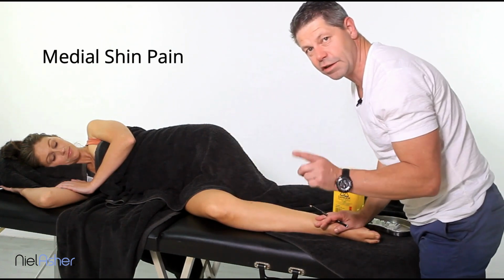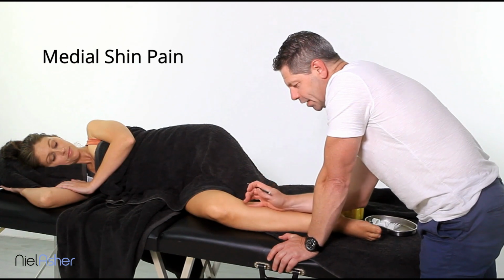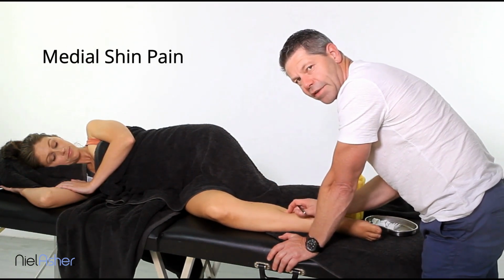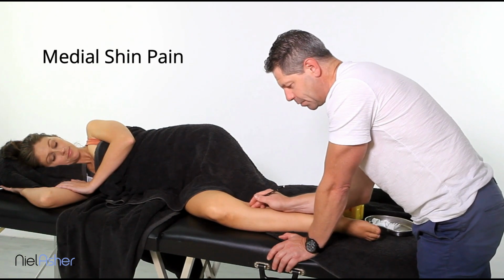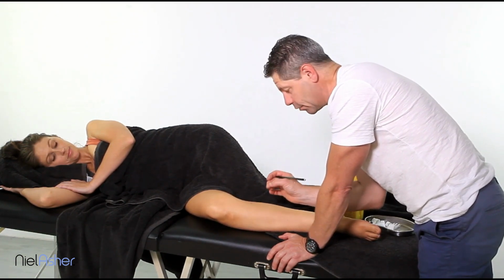So these are the ones that we're going to focus on. Now, in order to needle these areas, the deep compartment, this is so important: it is the edge of the tibia that we want to find. That's our bony landmark, and it is so important, because we're going to needle up against that and then down. So the idea is that we will hit the tib post, the flexor dig and so forth, but it's the trigger points that we're after in those areas here.